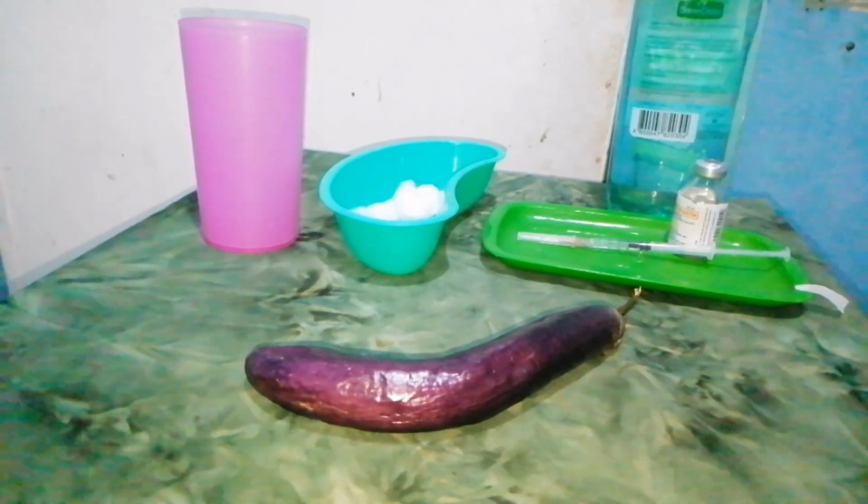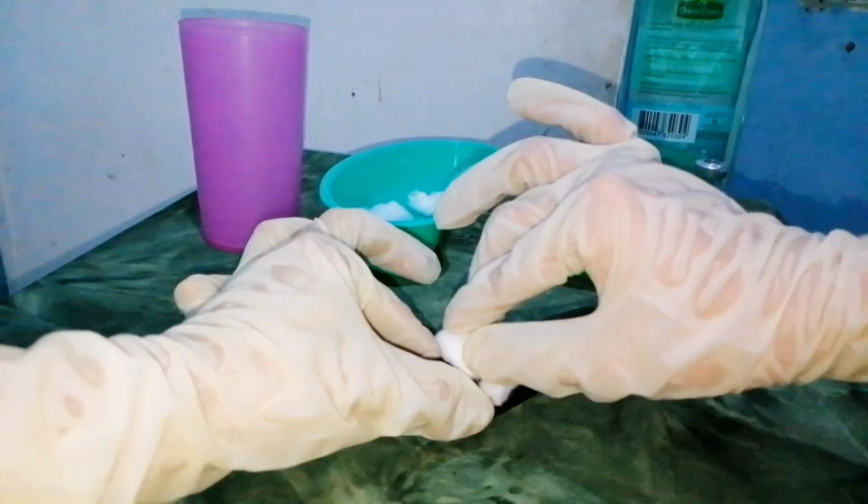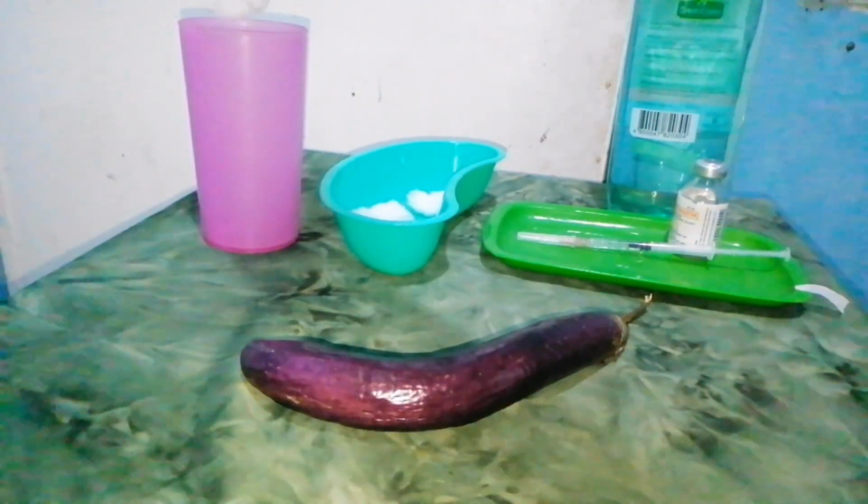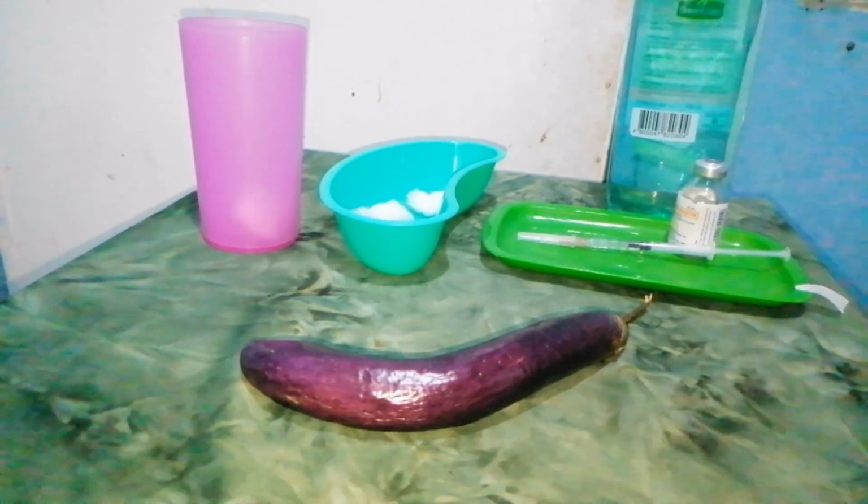Now, select and clean the site. Select a site on the forearm, about 3 or 4 fingers above the wrist and a hand's width below the elbow. Avoid using sites that are tender, inflamed, or swollen, and those that have lesions. Apply gloves as indicated by agency policy and cleanse the skin at the site using a firm circular motion. And discard. So now, prepare the syringe for injection. Remove the needle cap while waiting for the antiseptic to dry.